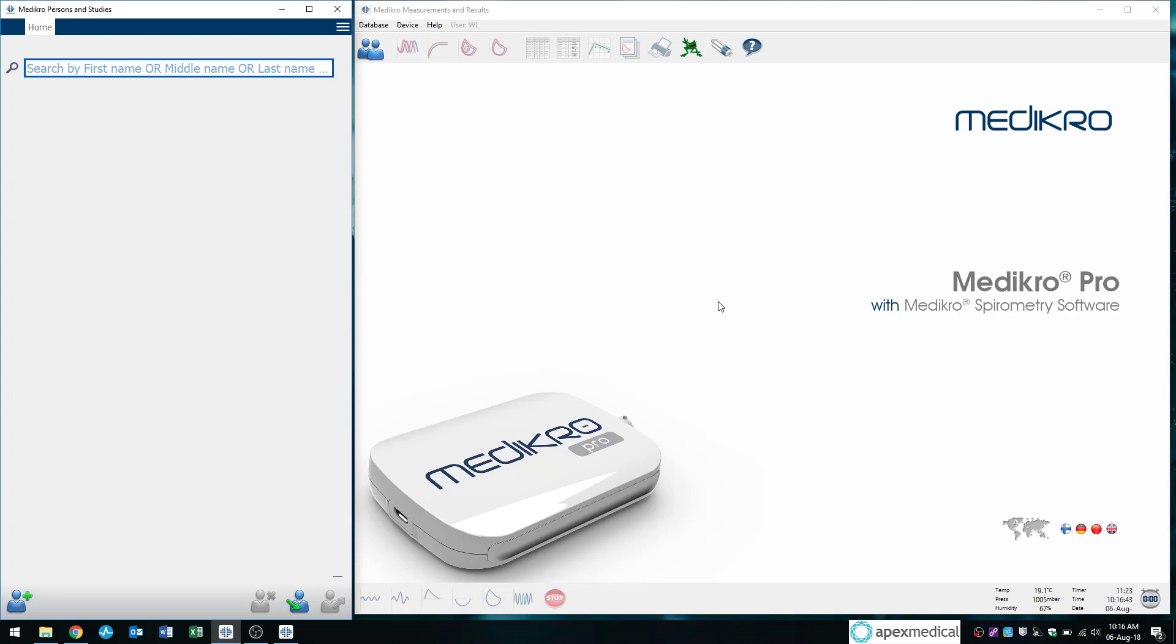In our previous video, we covered how to sign into the software and how to perform a calibration check. So in this video, we'll go through how to enter patient details, patient demographics, and also how to perform spirometry itself.